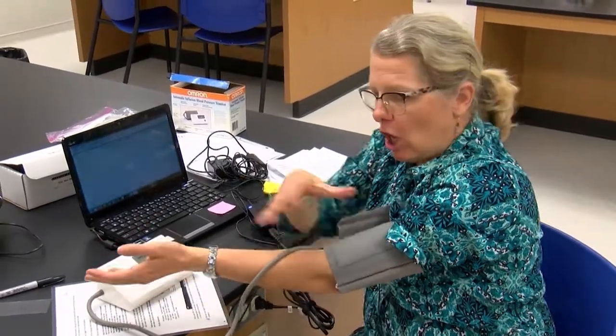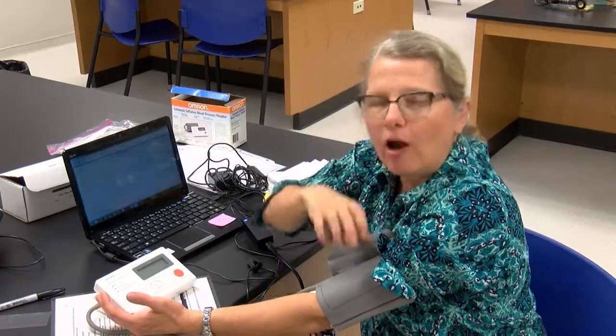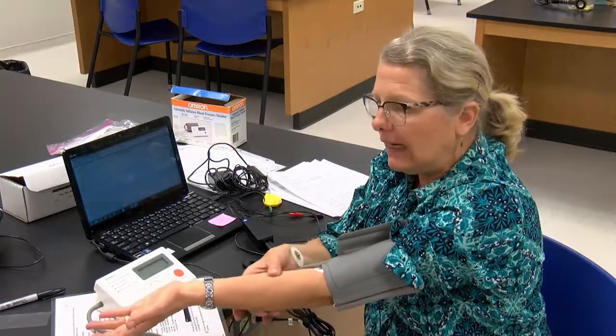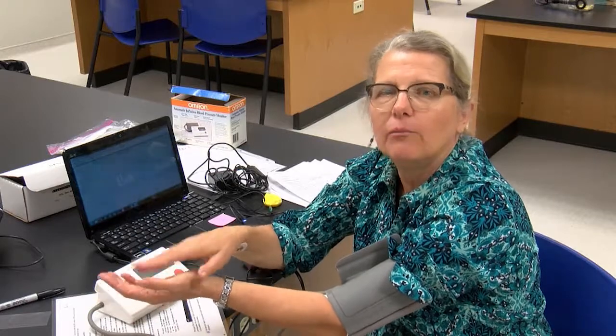And then the cuff is going to slowly release that pressure. While it's at 170, no blood will be getting through to my extremities. Okay? No blood will be getting through. When it reaches my blood pressure, which is, again, the systolic, the squeeze of the heart, now blood can slowly start getting to my extremities. So you never want to take someone's blood pressure, get it pumped up, and then walk away and get a sandwich or something, because their extremities aren't getting blood and your cells die after just a very short time if they're not getting blood.